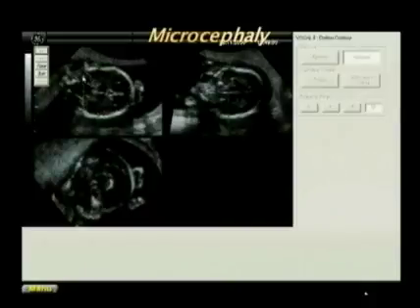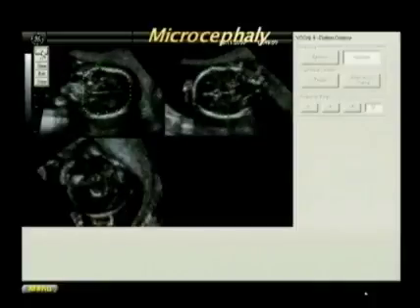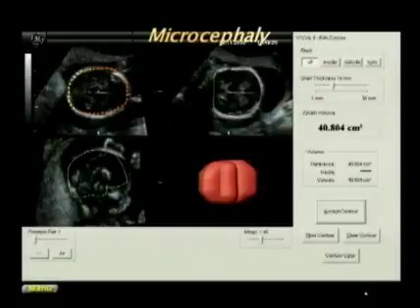Now that appears like a very tedious thing to do, but once you have done a couple of them, this is not such a hardship, and further it provides a much nicer assessment of the brain volume than simply a guesstimate from the two-dimensional structure.